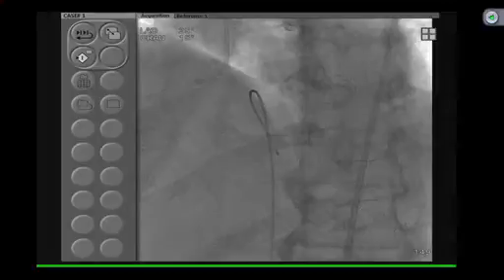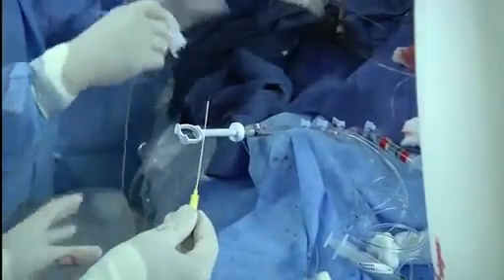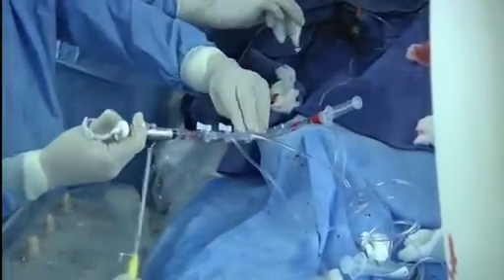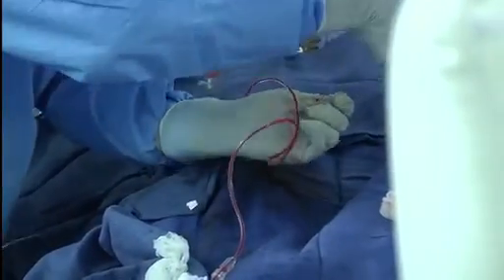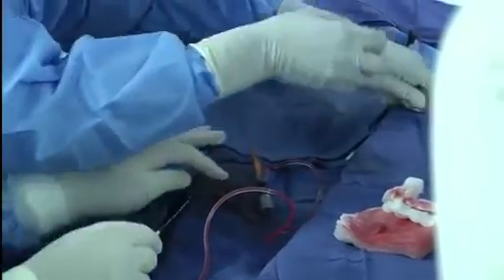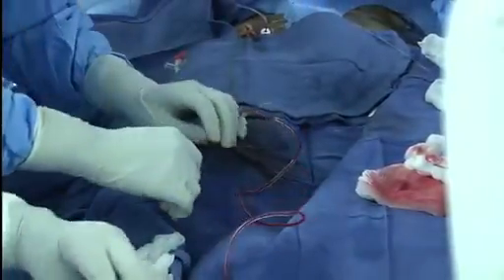See, another thing also happens while you are waiting. We had the rotor drip on, which can make a big pool. So when you are cleaning the rotor wire, it is very important that you make 3 loops, go underneath the tubing and keep it on the side. Anu, maybe in one of the archive cases we could also prepare a slide on the components of your rotor drip. Yes.